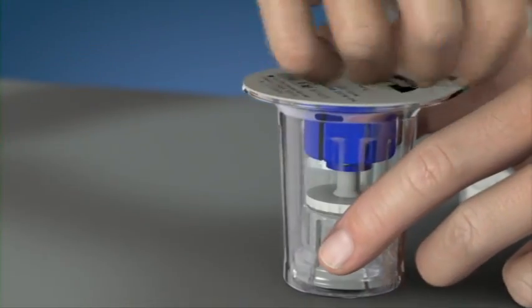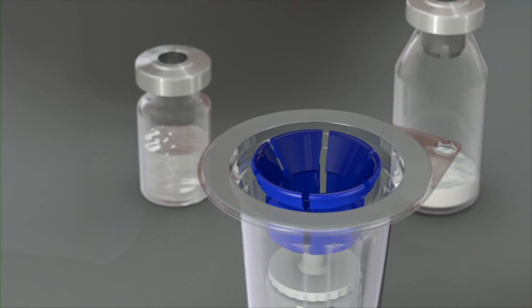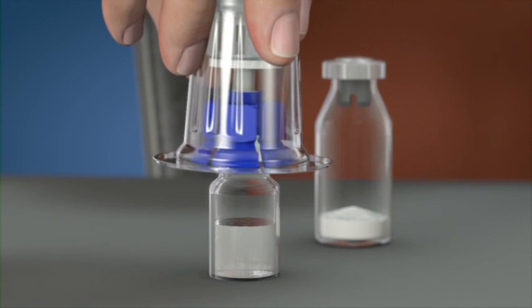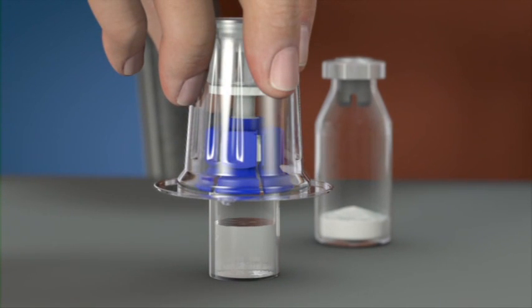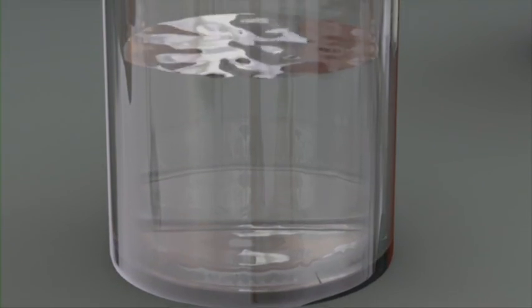Open the Mix2 Vial package by peeling away the lid. Place the diluent vial on an even, clean surface and hold it tight. Take the Mix2 Vial together with the package and snap the blue end onto the diluent stopper. Carefully remove the package from the Mix2 Vial set.